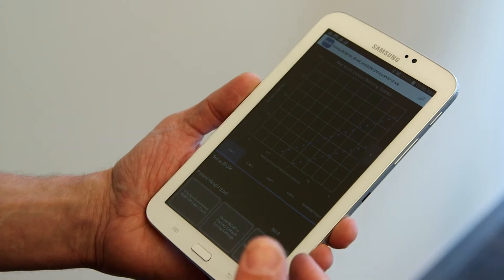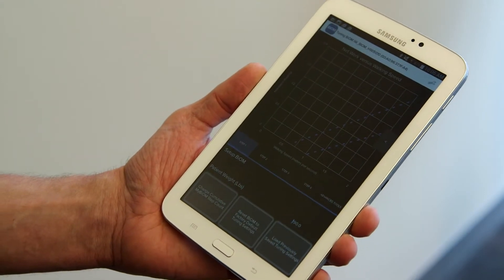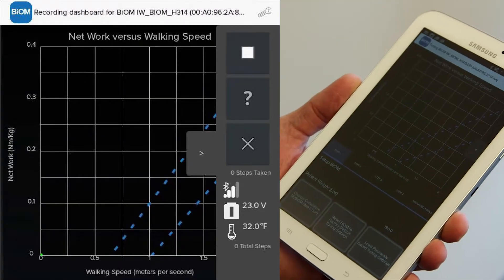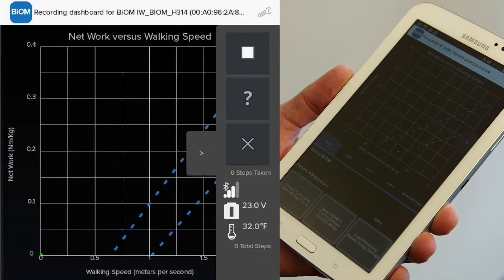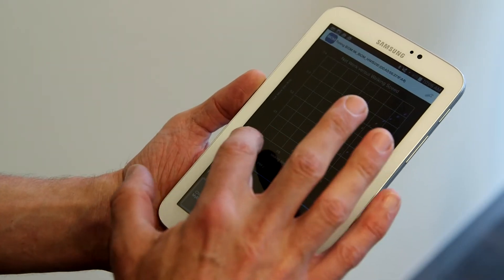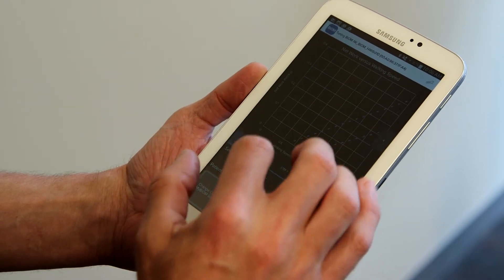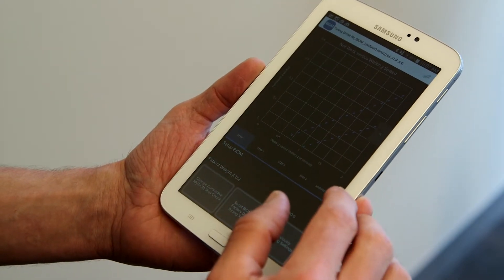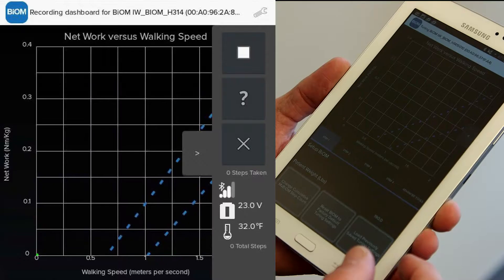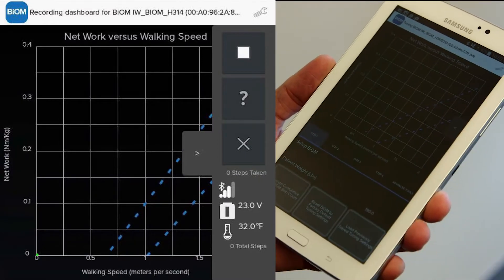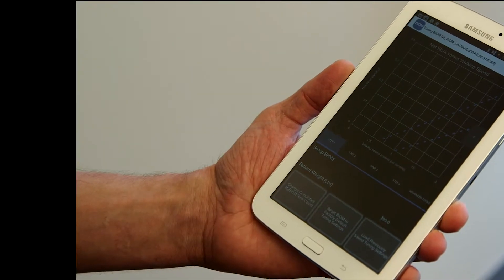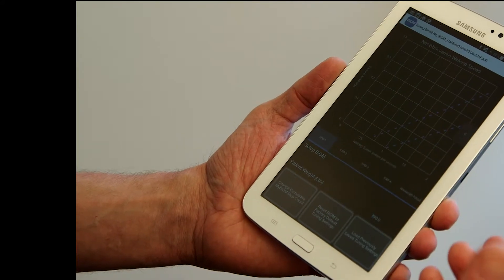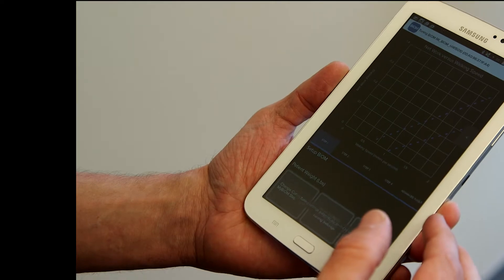Once we've successfully connected to the ankle, it's going to take us into our home tuning page. The first thing you'll notice there is this large graph in the center of the tablet. The graph is a net work graph, and that's literally what it measures for the patient when they walk. Here we have the amount of net work that the ankle is doing across these walking speeds. We have a range of zero to two meters per second, all the way up to 0.4 newton meters per kilogram of net work. You'll also notice two dashed blue lines in the graph. The space in between those lines represents your target range when you tune the ankle. This area represents the optimal amount of net work that the ankle should be doing across these walking speeds.